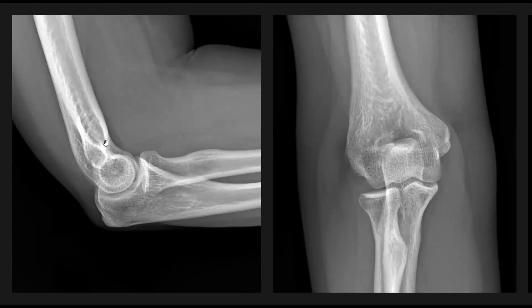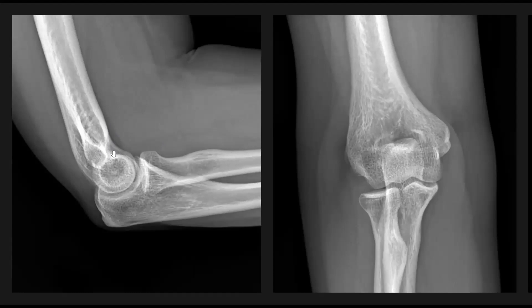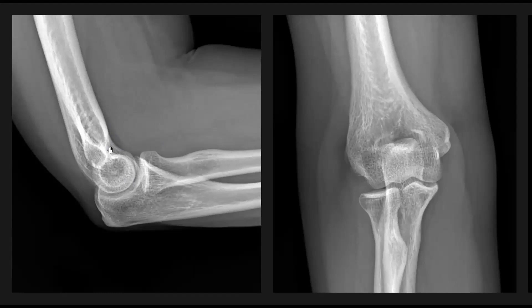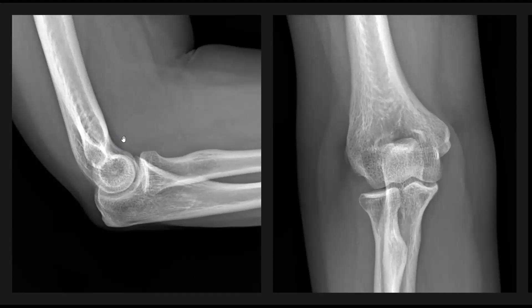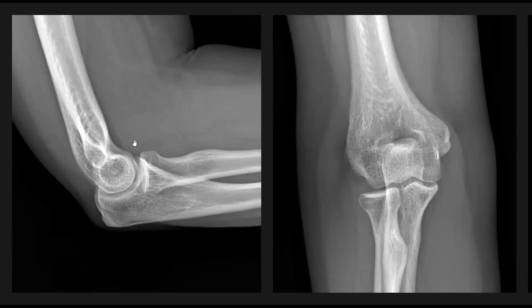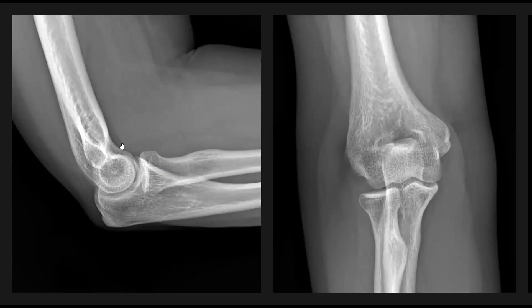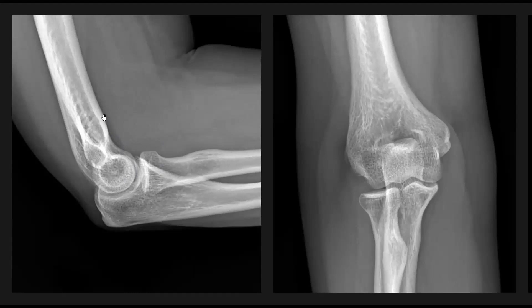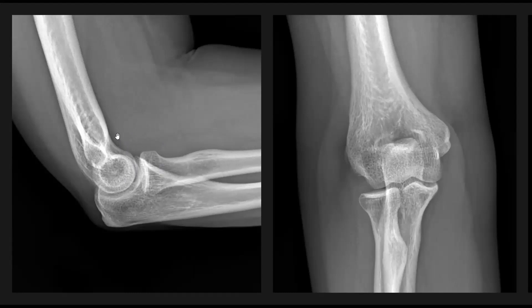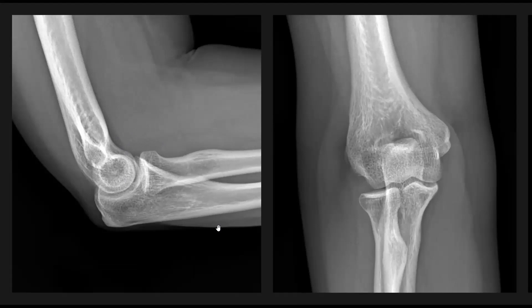A joint effusion will basically distend this fat pad and displace it anteriorly. So you need to see it nice and flush against the distal anterior humeral cortex.